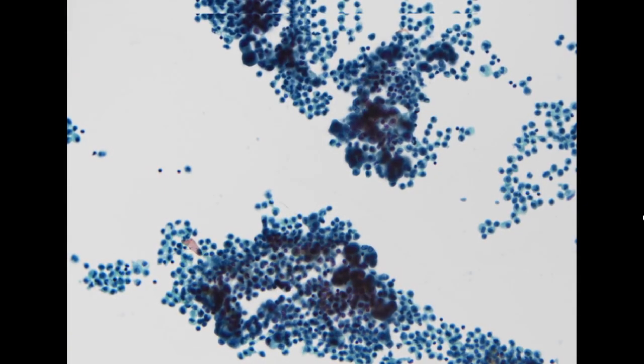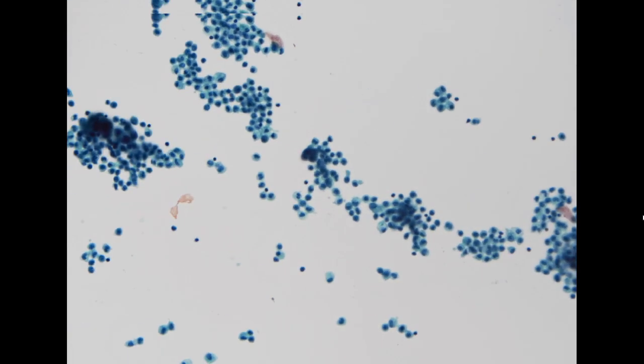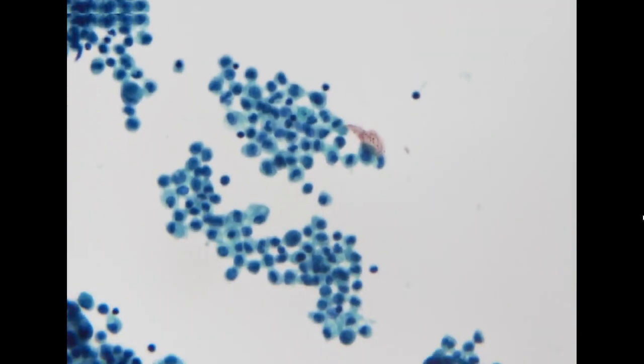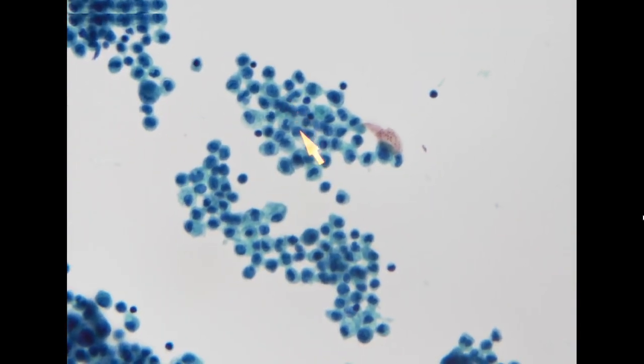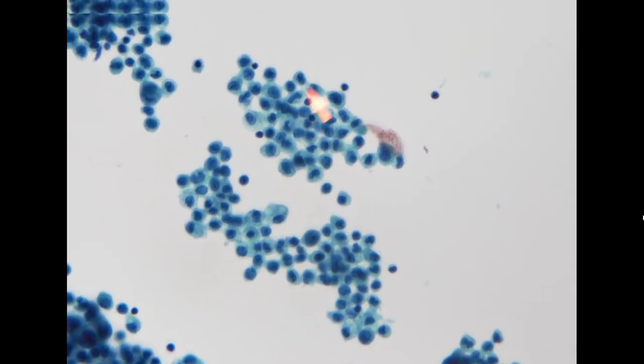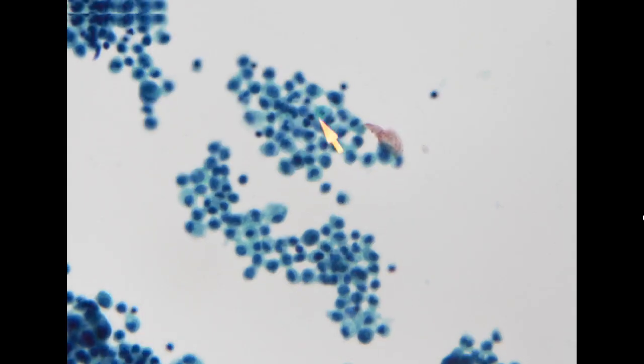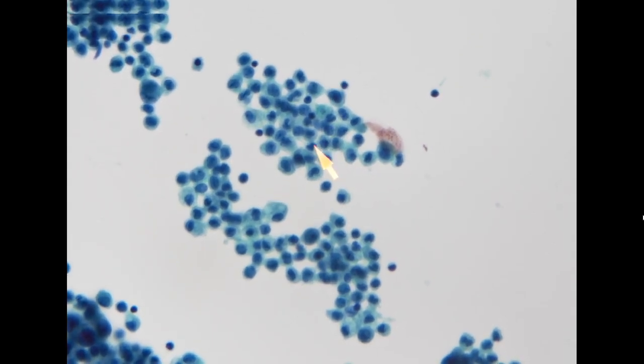Because the specimen was prepared on Monday, and usually on Monday we will change our staining solution, it is a little bit too dark in the nucleus. So you need to know the chromatin of the benign reference cell first. Here are the mesothelial cells and histiocytes, a little bit darker than usual, probably because they changed the solution. So this is our normal chromatin now. You always need to go to the reference cell in the background.